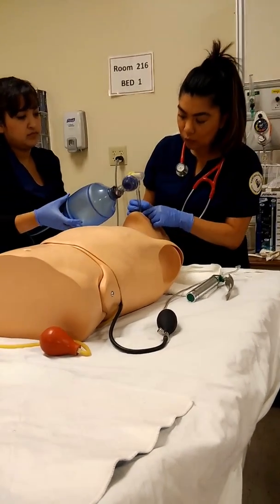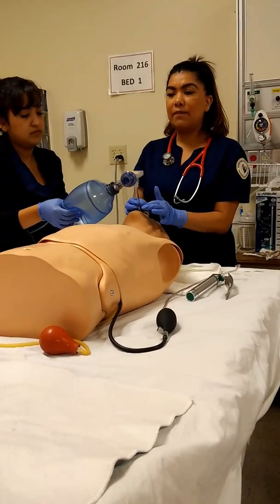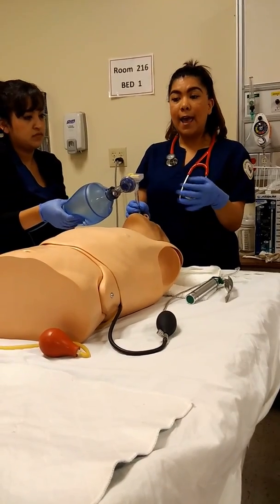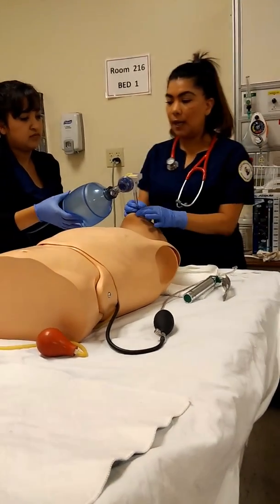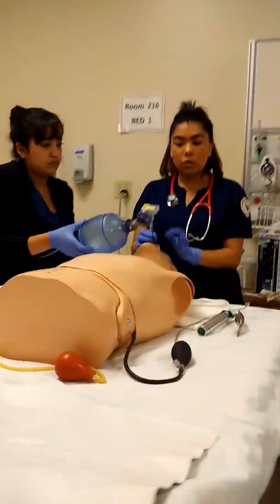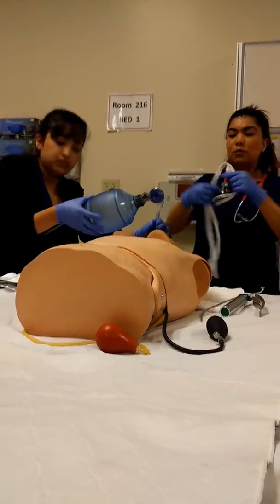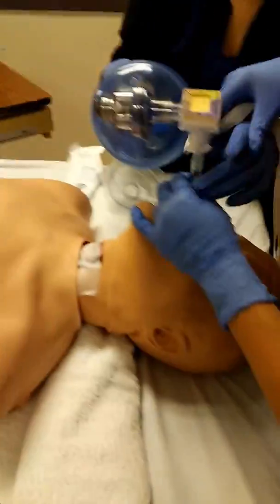Right now, so again, we would be checking, having an X-ray to see if it's too far in, then we would go ahead and readjust the endotracheal tube if that were to be the case. Okay, so then if you could just go ahead and hold the tube. Now I'm going to secure the tube. So I'm going to use my ties here. If you could just go ahead and hold it up here for me, please.